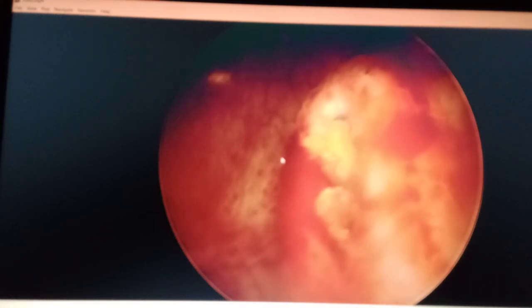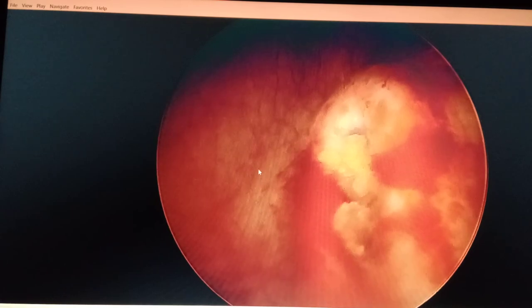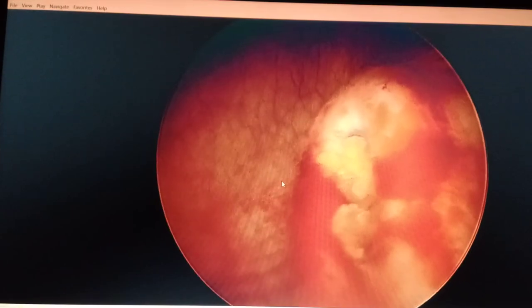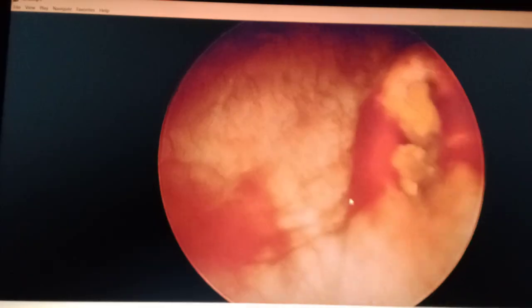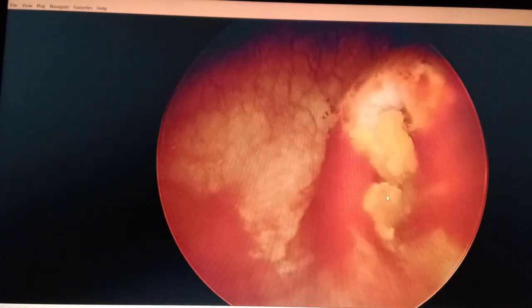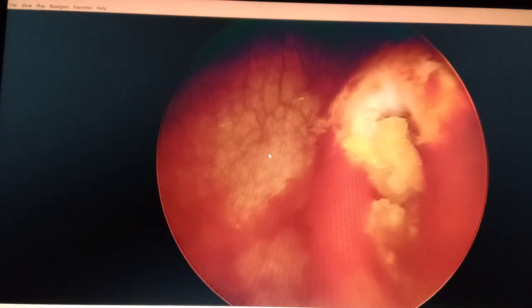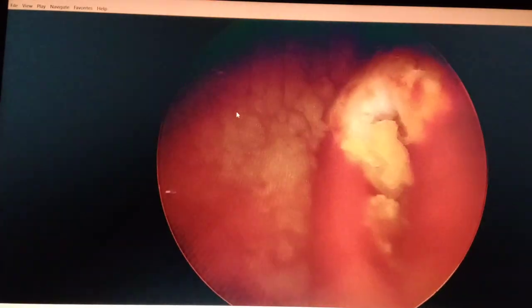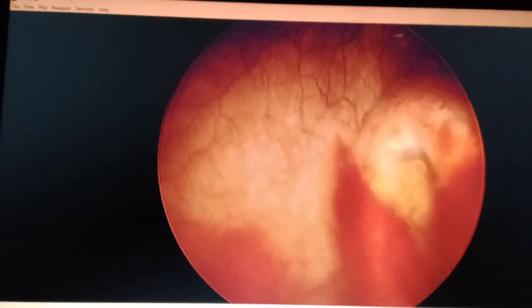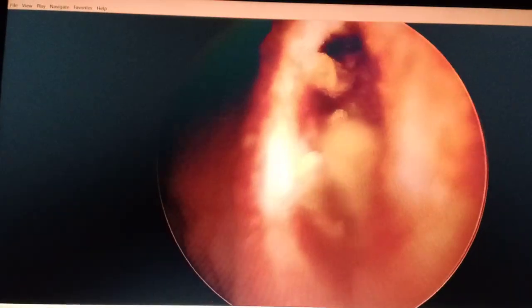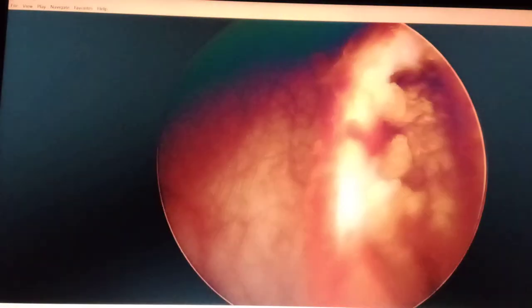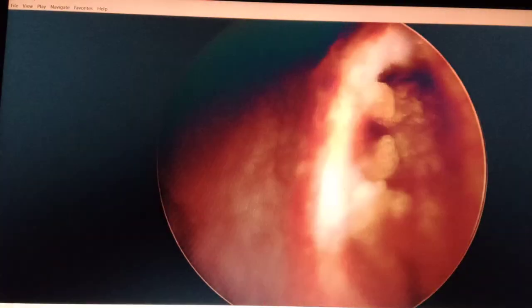The whole idea of using mechanical disruption followed by pneumatic use is to create space here so that we can enter the ureteric opening. You can see some sort of flakes. Just using irrigation — hydrodissection — I am just waiting; irrigation will do its part and it is going to help us. Let the bladder drain.